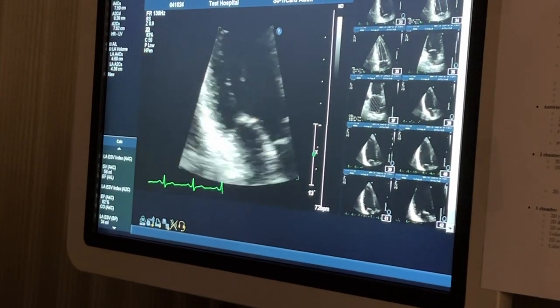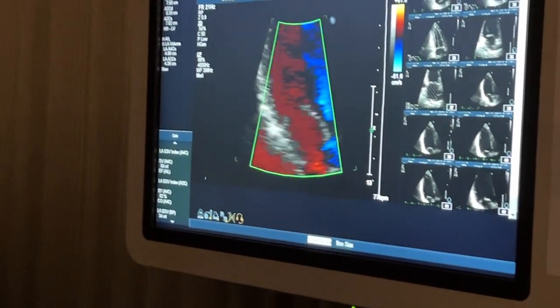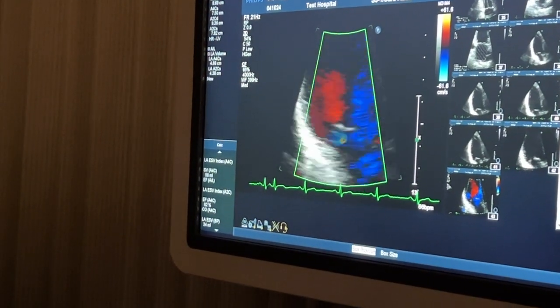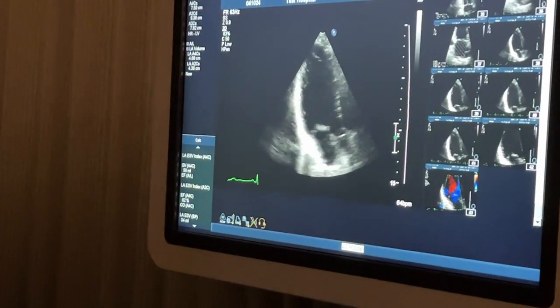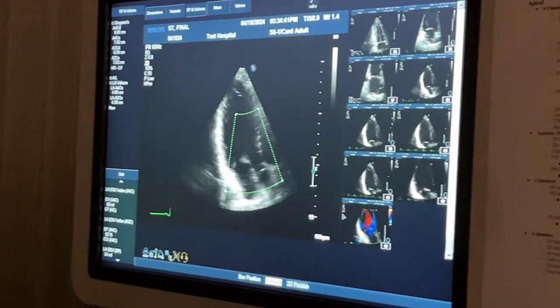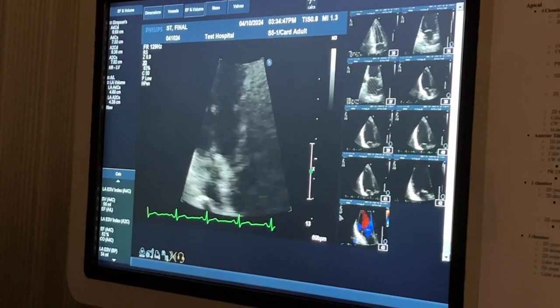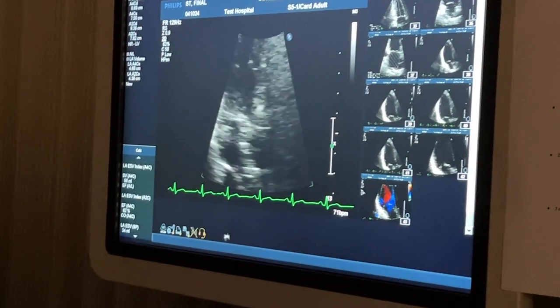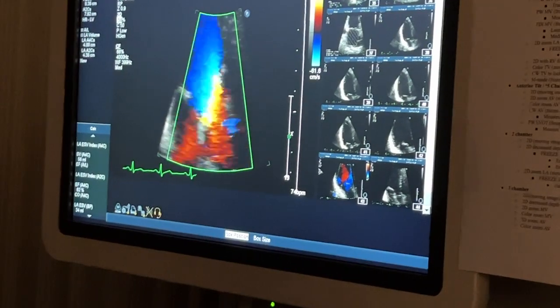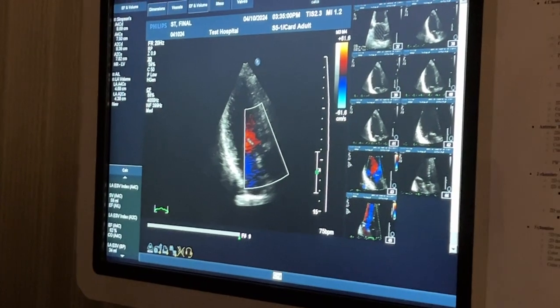So while still zoomed, you're going to put color on your zoomed mitral valve. So kind of the same idea. You just want to see color really up close. And I can take that picture. Now I'm done on the mitral valve. I'm going to come out, take color off. I'm going to do the same thing for the aortic valve. So now you're going to 2D zoom the aortic valve. Take a picture of it first with 2D just moving. And then you're going to put color on it while still zoomed. Ready? All done. That's your final.